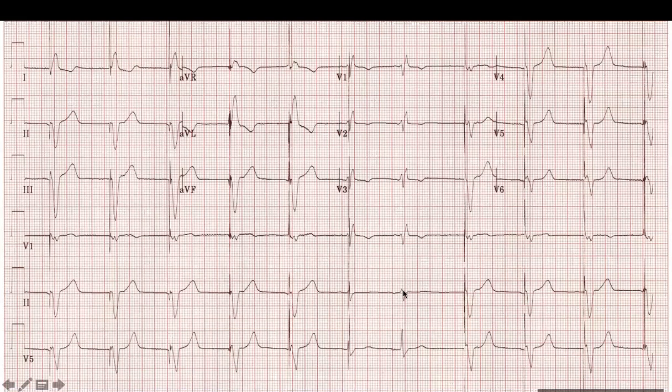So there should be a spike over here. The pacemaker already sensed that there is an intrinsic QRS activity, so it inhibits the pacing and resets the counter. If it's programmed at 60 beats per minute, the next beat should happen after 1 second. You wait for this 1 second, and then over here happens the spike. So the pacemaker RV lead is functioning well in terms of pacing and sensing, right? Yes. Okay.